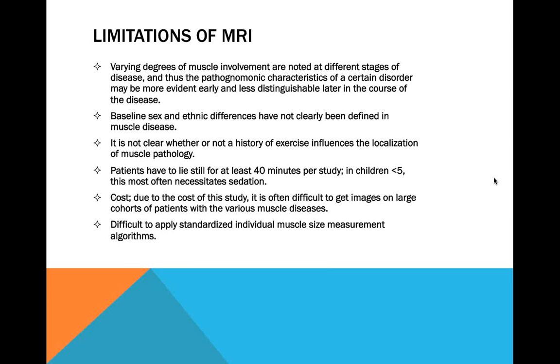Other limitations is that the patient has to lie still for at least 40 minutes per study. In children less than 5, this most often necessitates sedation, and particularly for research studies where the patient has a diagnosis already, I think a lot of parents are hard-pressed to put their kids through sedation to get follow-up studies to see if the child is responding to therapy. So that's one problem there. And also cost. MRIs are really expensive. I think a couple $1,000s each time they run. And so you can imagine how hard it is to get funding for these studies.